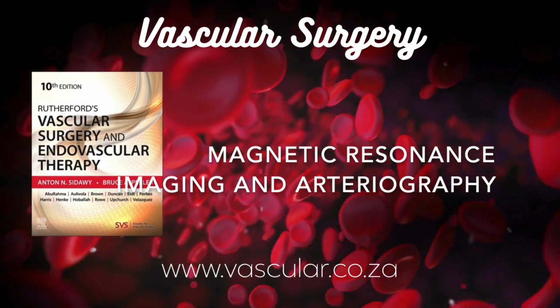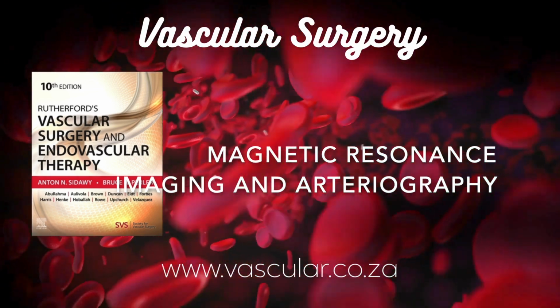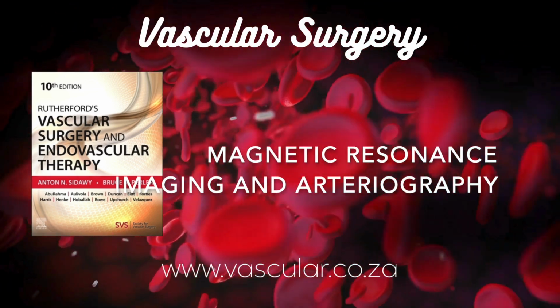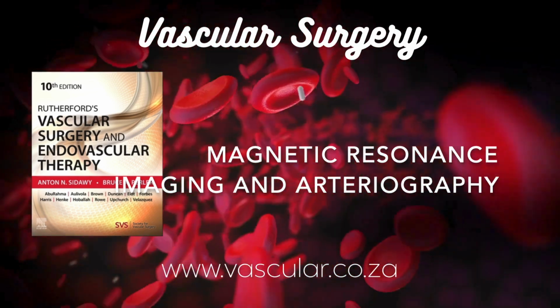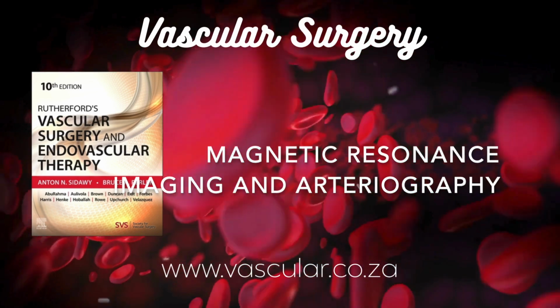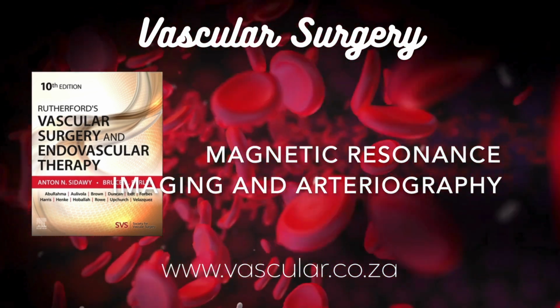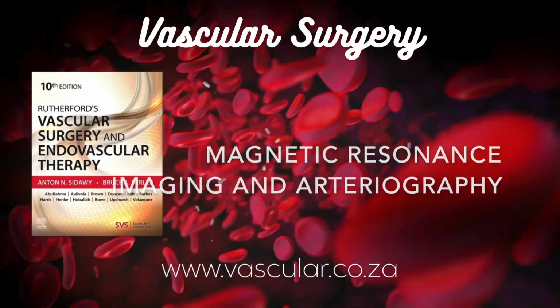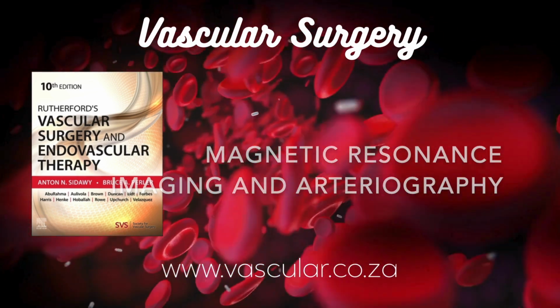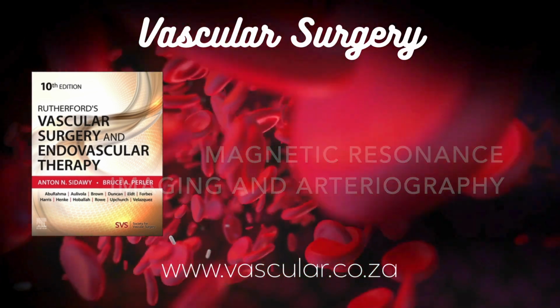Huge role. MRA is very sensitive for picking up atherosclerosis plaque buildup in the carotids. It's particularly good at identifying significant narrowing or stenosis, say in that critical 70% to 99% range. So it helps decide who needs surgery or stenting. Exactly. Because it's pretty accurate in grading the stenosis, many centers use MRA as a key tool for planning those carotid revascularization procedures to prevent strokes.